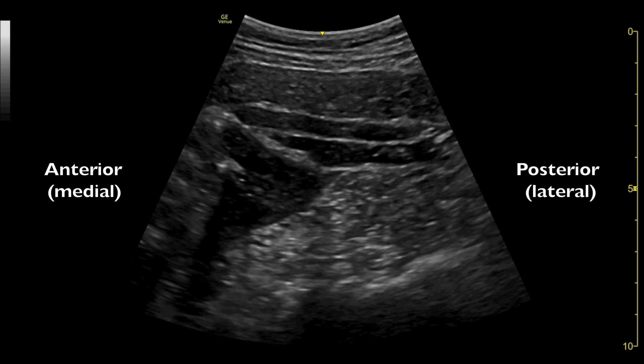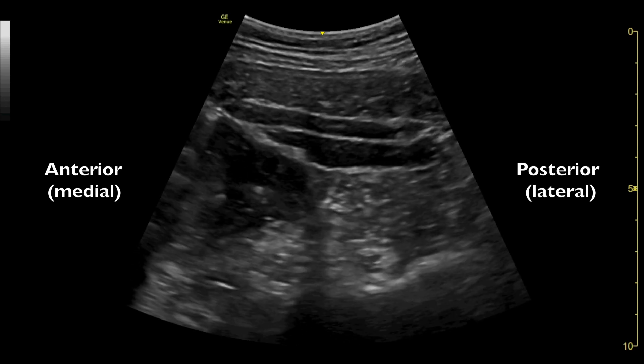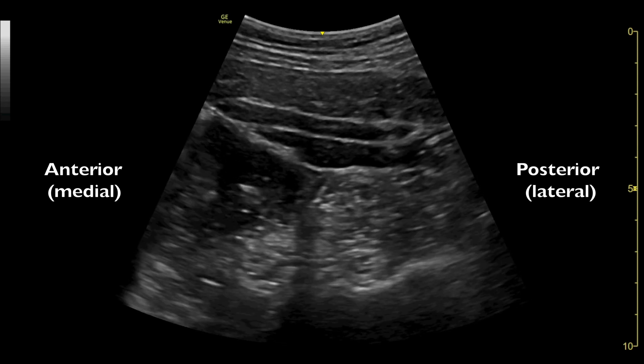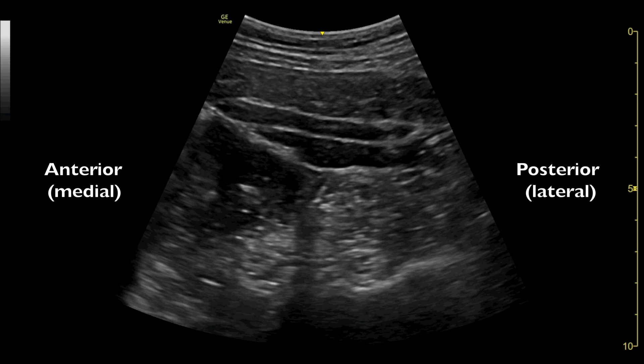We will be able to see the peritoneal cavity, the kidney with its surrounding fat, and the three layers of abdominal wall muscles — namely the external oblique, internal oblique, and transversus abdominis.